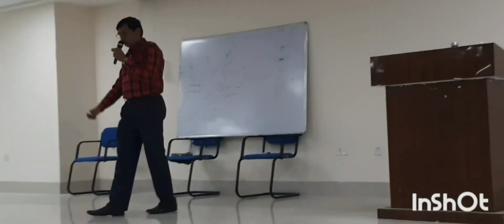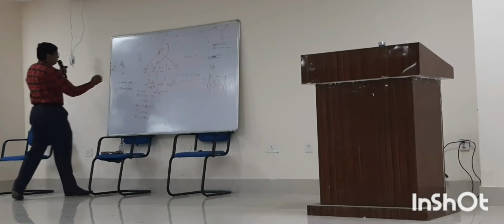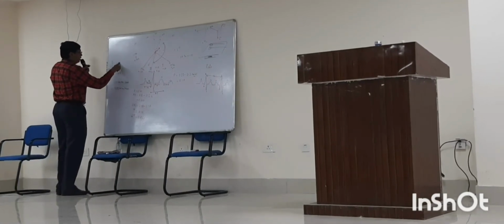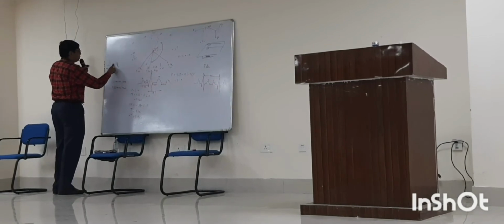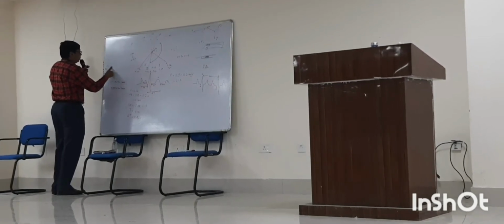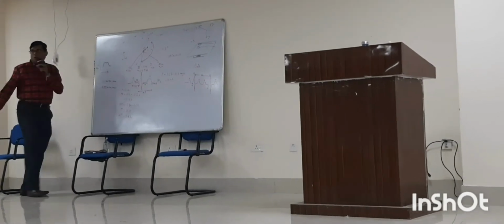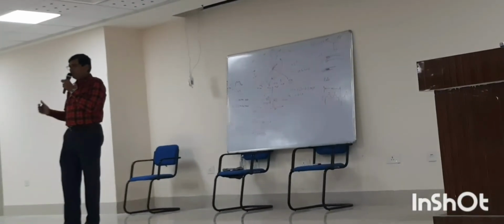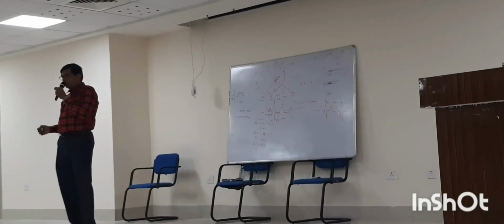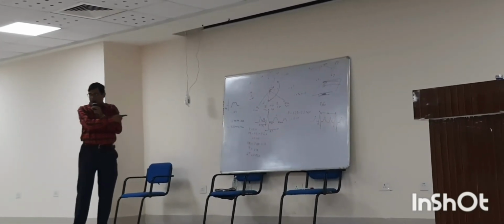If it is more, the shape of the curve will be like this, and it is called P mitrale or left atrial dilatation. It looks like a camel hump.